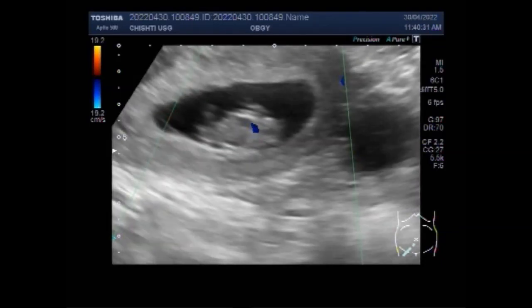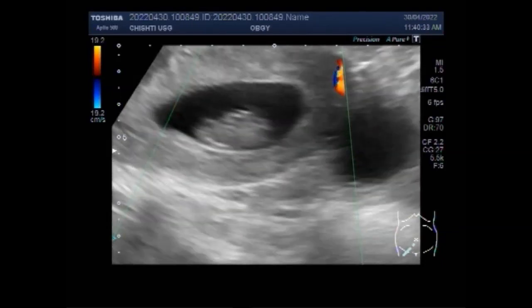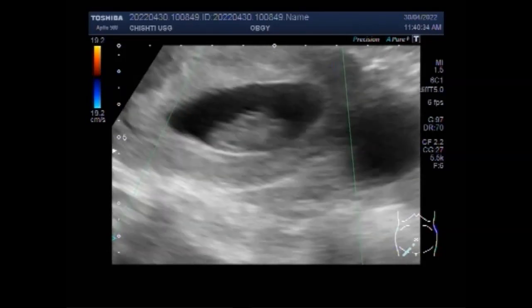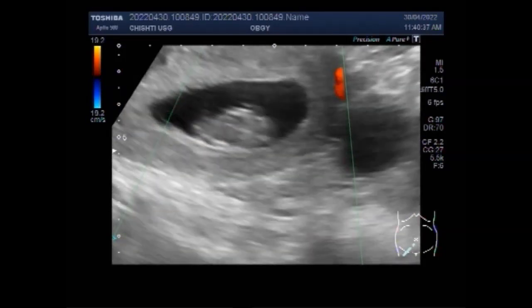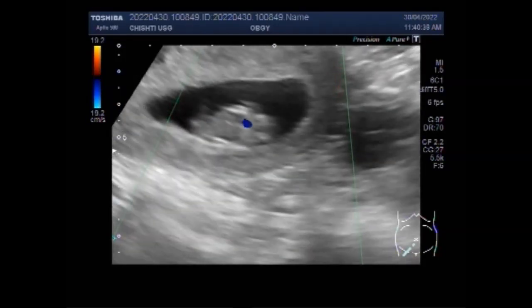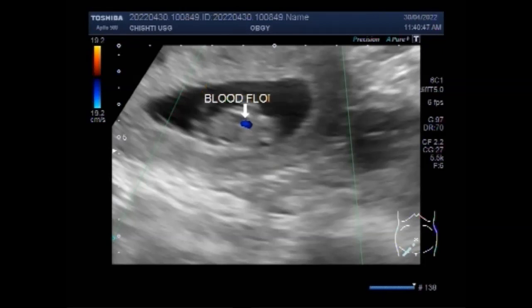Now you can see the blood flow inside the fetus, inside the fetal heart. This is the blood flow seen in the fetal heart.